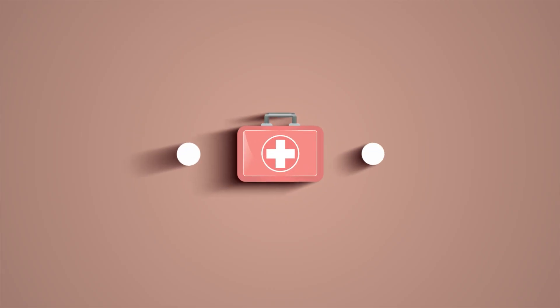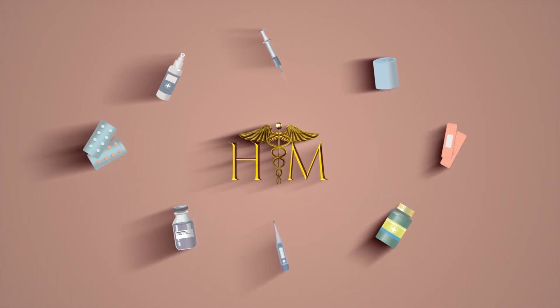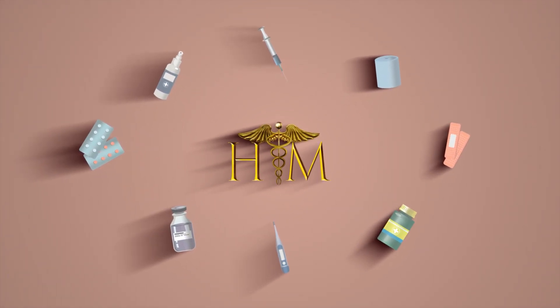In this video I'm going to show you how to do a figure of eight. As a dermatologist, a lot of the skin surgery we do are biopsies — this is where you take a small sample of skin to investigate an undiagnosed rash or maybe a lesion you think might be a skin cancer. When you take a punch biopsy you're often left with a circular shaped hole, because you use an instrument that's like a hole punch to literally punch out a circular area of skin.